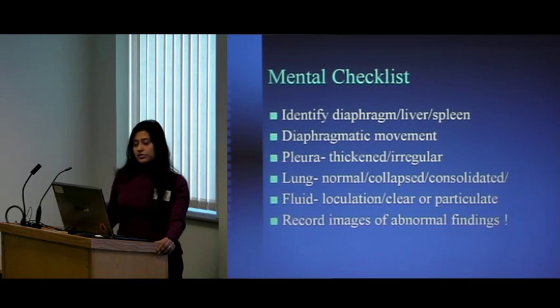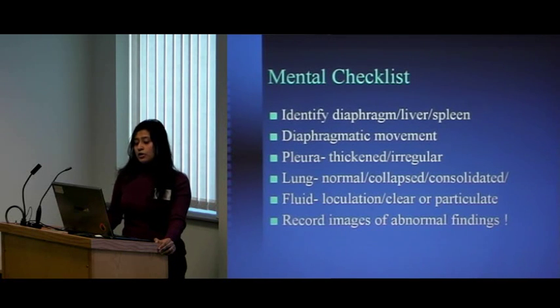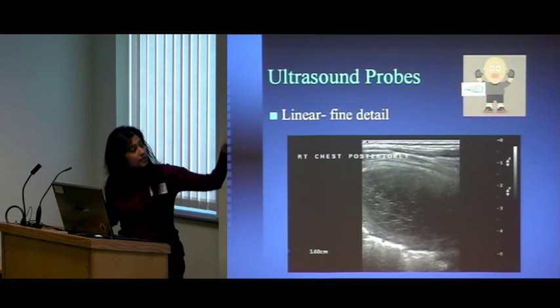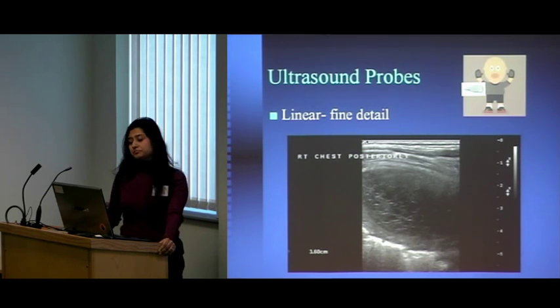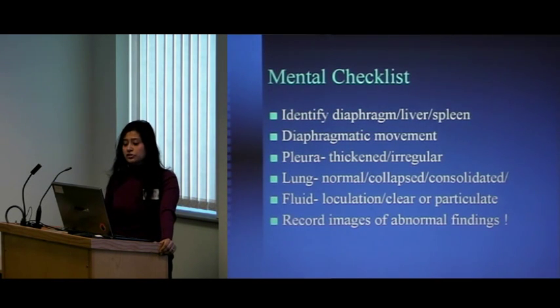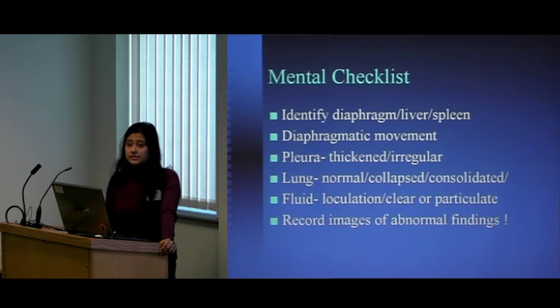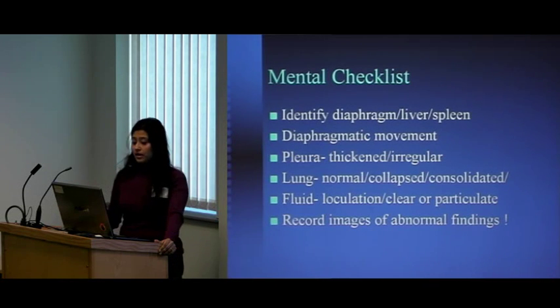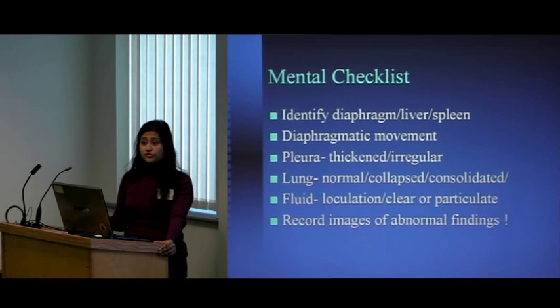It's useful to have a mental checklist. Identify the diaphragm, liver, and spleen. Look for diaphragmatic movement. When looking at the pleura with the linear probe, you can see chest wall structures at the top, then the two layers of pleura and fluid within — check if the pleura is thickened, irregular, or has nodules. The normal lung can't be seen because it's full of air, causing a large acoustic impedance mismatch that reflects all ultrasound waves. However, if the lung is full of inflammatory material or fluid, you can see it as an echogenic structure moving with respiration.